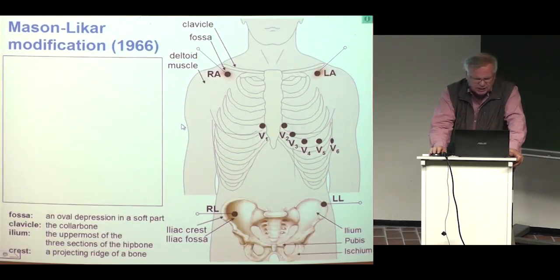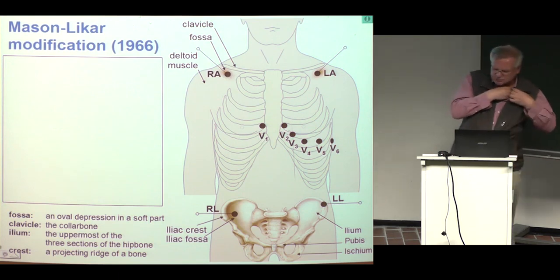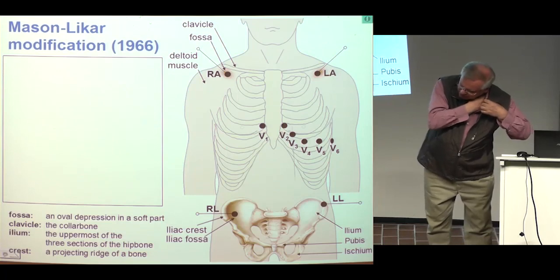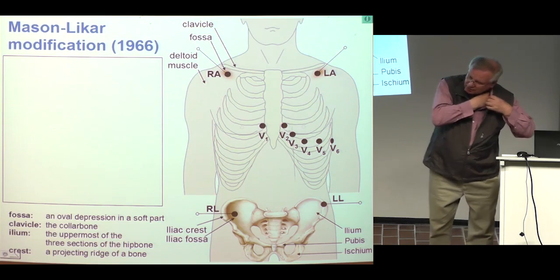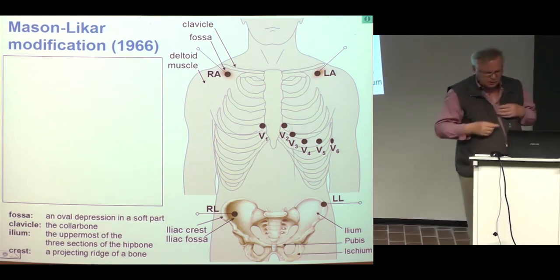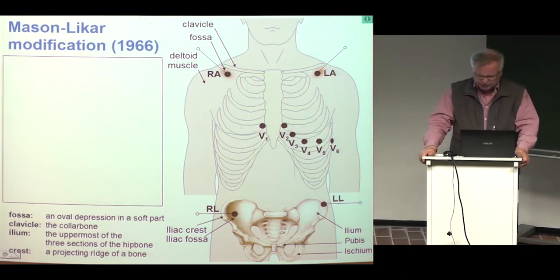So in the Mason-Likar modification, the idea is that there is a place under the clavicle where there are no muscles. I usually ask students to try: if you take this position under the clavicle bone, you find a kind of deep region here. Just please try it. Under the middle of the clavicle bone, it's a deep pit, and therefore there is no muscle, or practically no muscle. Because there's no muscle, there's no noise from muscular activity. So that's a smart invention.